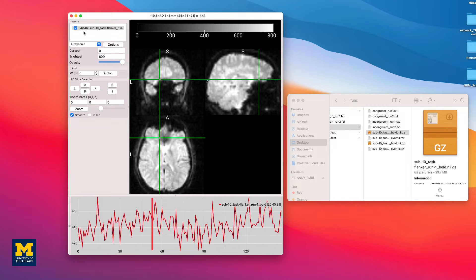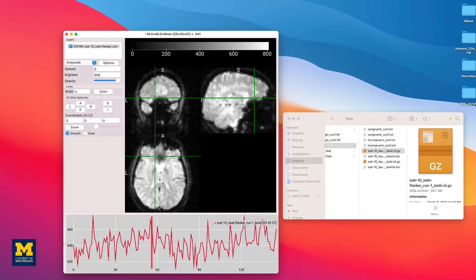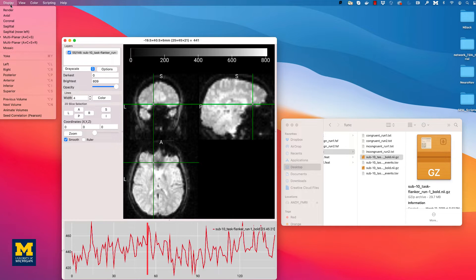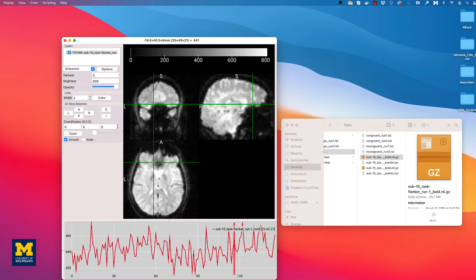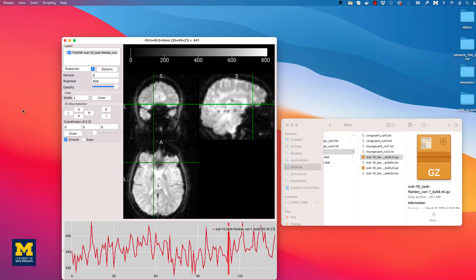You can flip through the volumes by either pressing Option and N to advance one volume, or Option plus V to go back one volume. Or, you can flip through the volumes automatically at a steady rate by clicking Display, then Animate Volumes. If you want to turn this off, again go to Display and uncheck Animate Volumes.